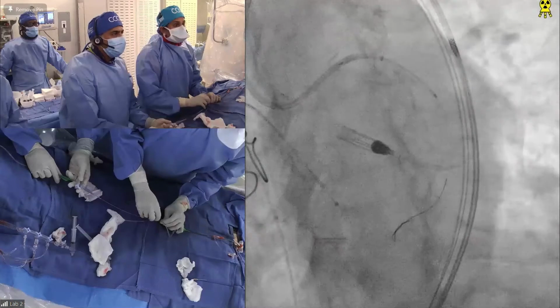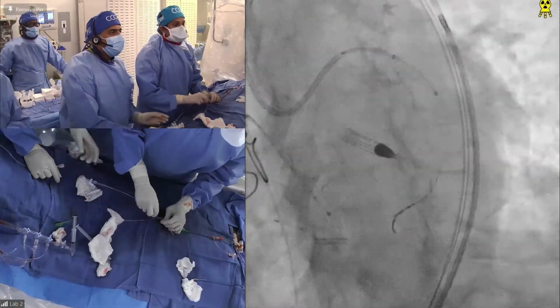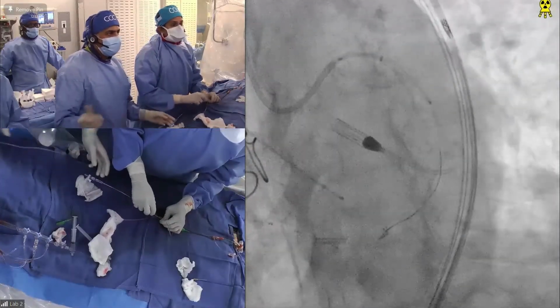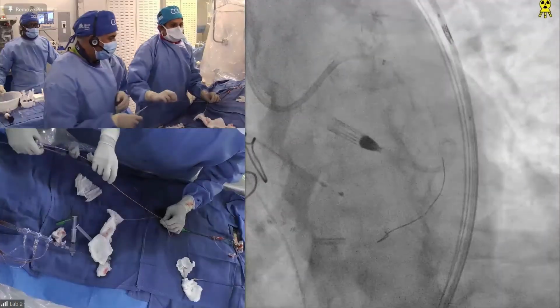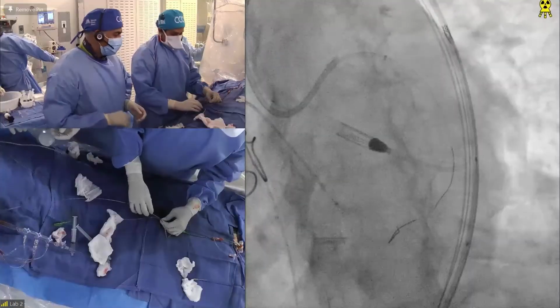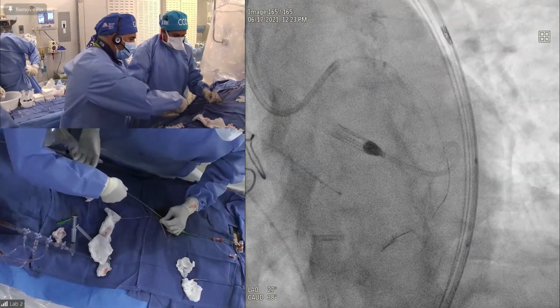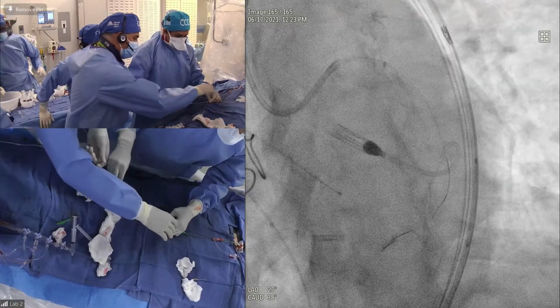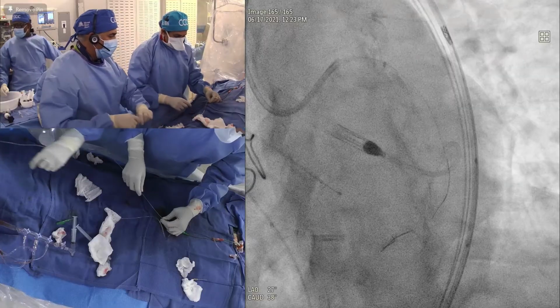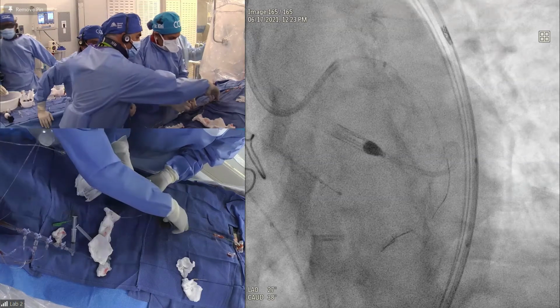So, which is next step? Antonio, are you happy with this? With this, you see the guideliner. What would you have done? Anything different? She's still having a hard time. I think too far, so high pressure, I would have done the same. As was mentioned, maybe after the 1.25, I almost always go with a 1.5. But the result is good. I think in this lesion, the dissection is expected. Yeah, substantial. It's a big dissection, but it's not malignant, not a big deal. No, it's okay.